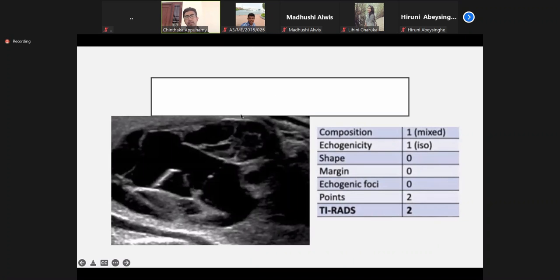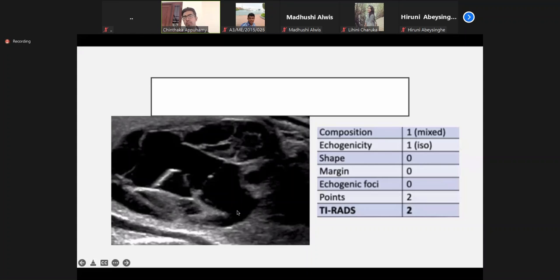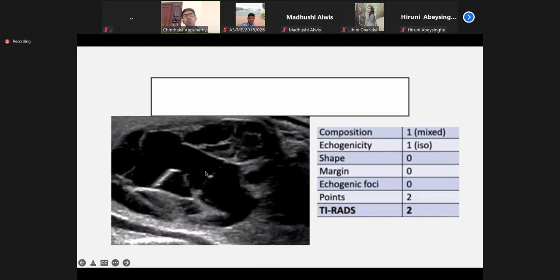This next nodule is more cystic with a lace-like pattern — more towards the spongiform appearance. More cystic areas, smooth wall, no calcifications. Again, either TIRADS 2 or 3 — TIRADS 2.